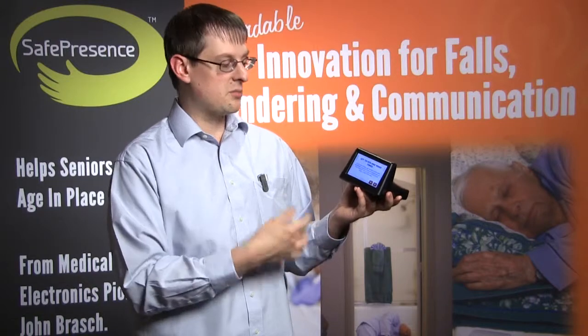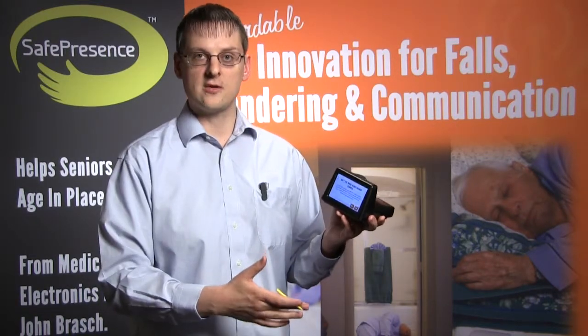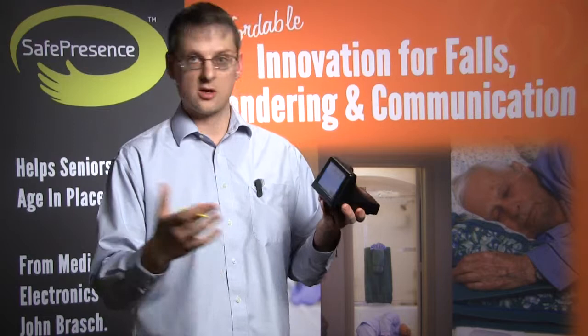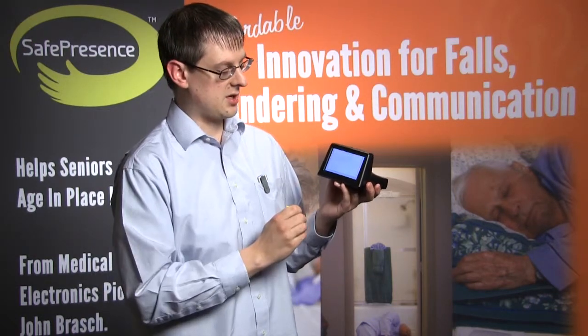And now we're going to get to the bedtime and wake time. This is the time that we're going to use to figure out if you should be in bed by now or if you should be waking up. Make sure to give yourself a little bit of leeway here just in case you happen to go to bed a little bit later. So we're going to hit next on that.